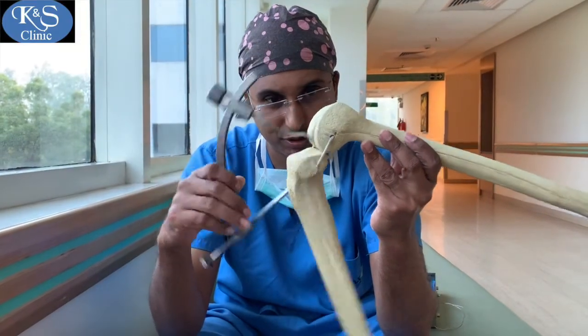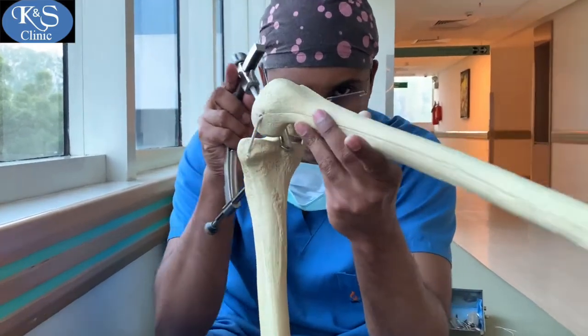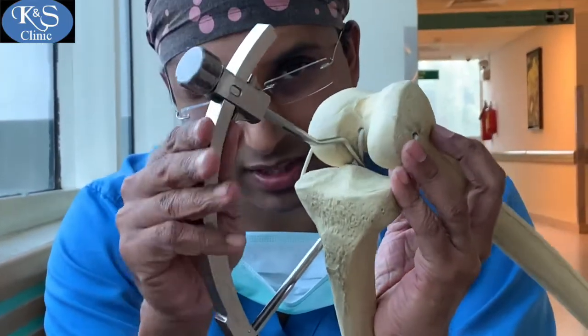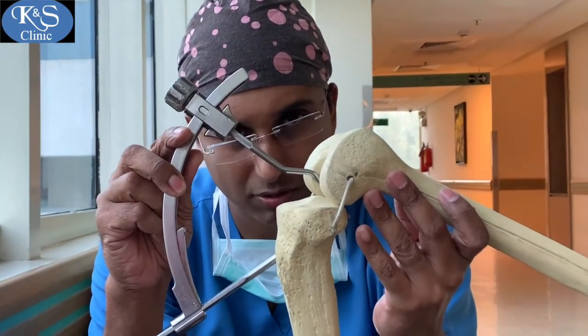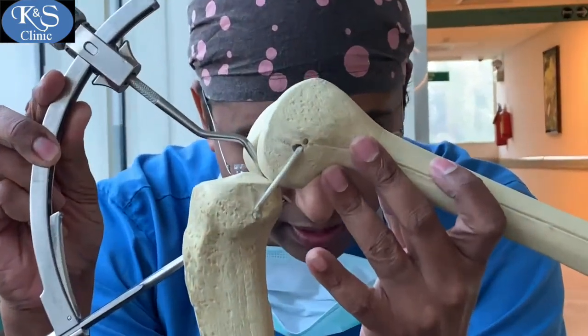The tibial jig is fixed on the anteromedial aspect of the tibia. Drilling then happens from the anteromedial aspect of the tibia all the way posteriorly, as can be seen where the jig ends at the back of the knee.